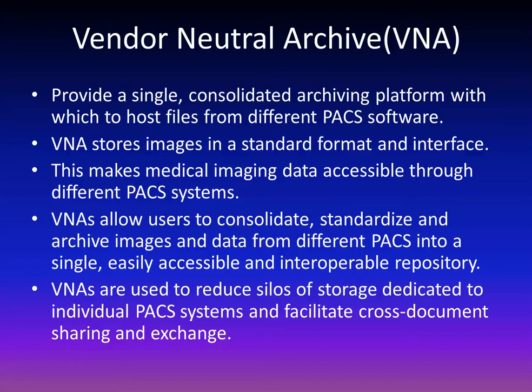That way, if you store all your data and you decide next year you're going to change PACS companies, if we hadn't used a vendor neutral archive, we may lose our data, or we may not be able to get our data back. And so this allows us to get our data back. It sets a standard that says all data that's stored has to be stored in this format. That way we can always get it back and use it as we need to.